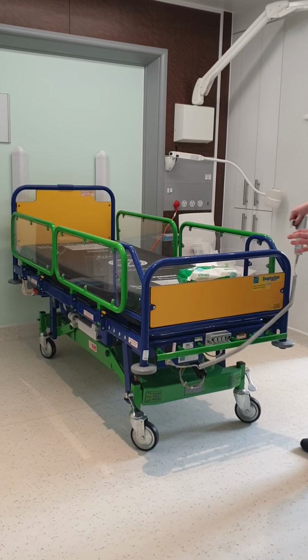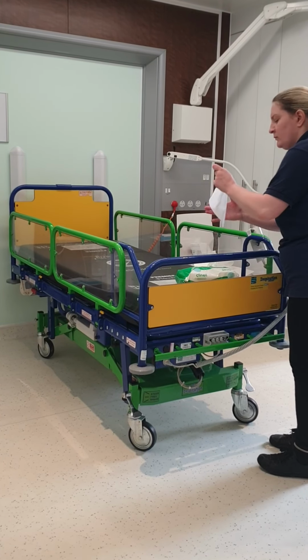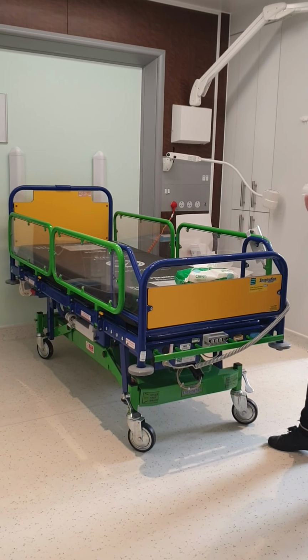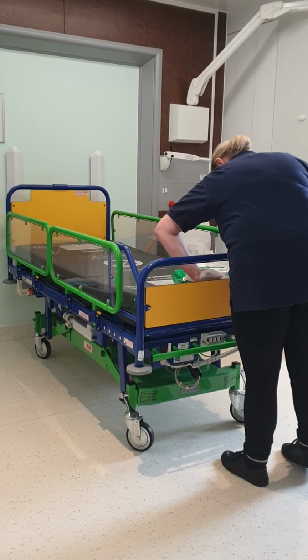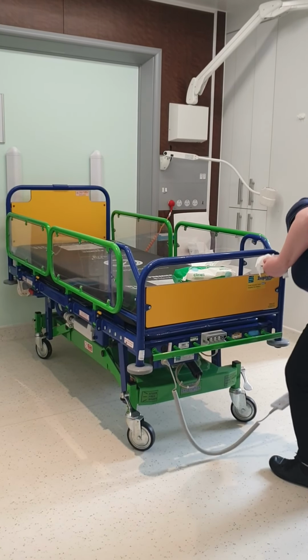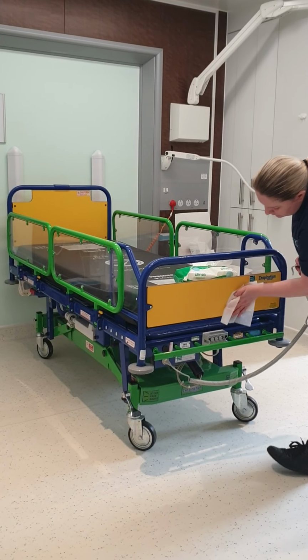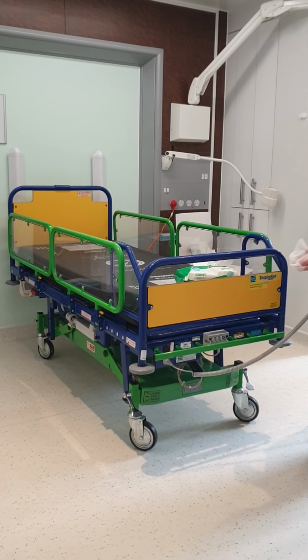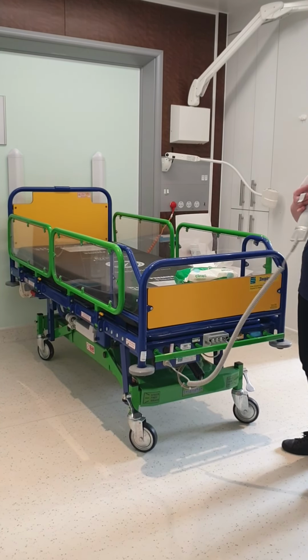Choose the right wipe, take one wipe at a time and open it out in its entirety. Clean the entire surface using an S-shaped motion and make sure that you only use one wipe for the amount of surface that you need. So one wipe per item, or if the item is bigger than a meter, make sure you swap out wipes every meter.